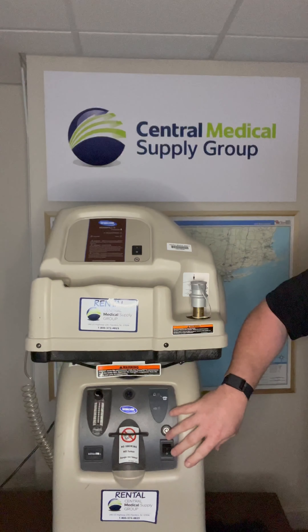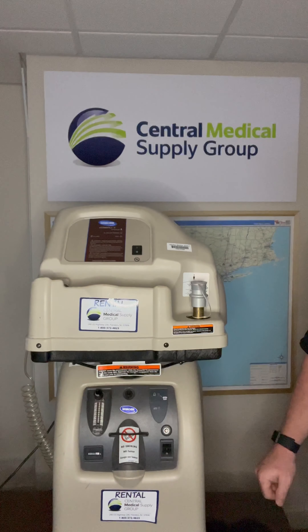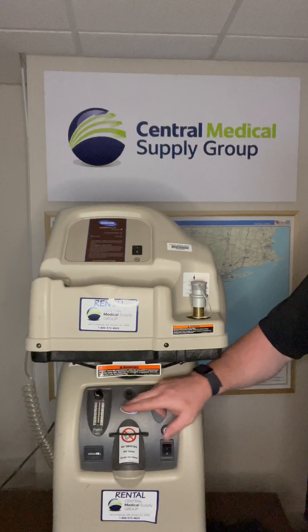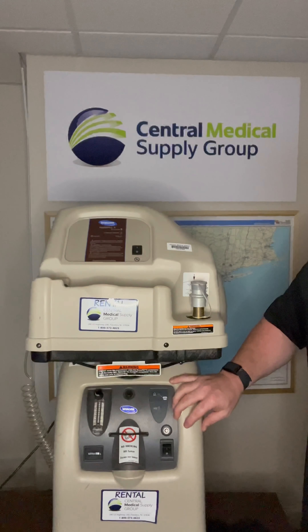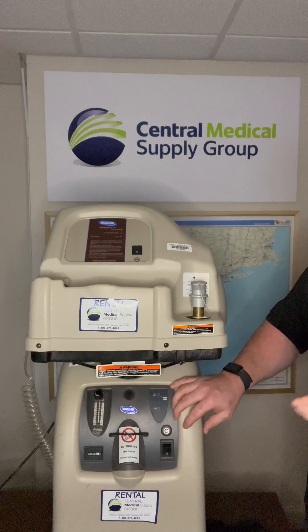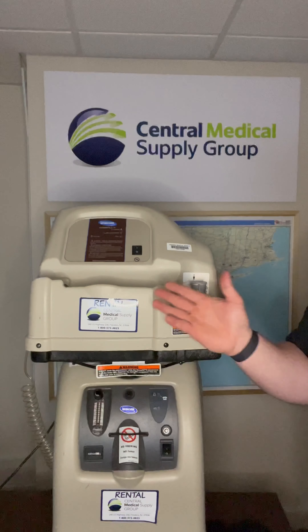If the concentrator is not needed at this point, you can turn it off. The patient can be connected to the concentrator while the home fill compressor is refilling a tank, as long as the concentrator's flow rate does not exceed three liters per minute. When the compressor is not filling a tank, the patient can use the concentrator up to its maximum flow rate, but the flow rate must be reduced again when filling another tank.